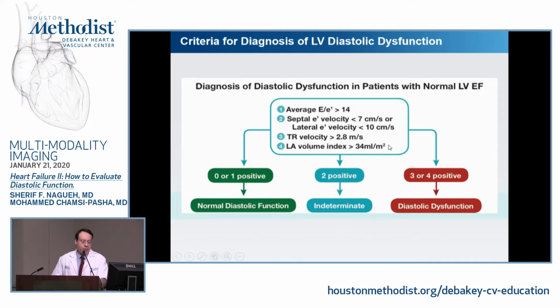As you can see, it's an important variable for diastolic dysfunction, but I would also submit it's an important variable that you want to measure correctly in all patients, be it patients with heart failure, with arrhythmias, with mitral valve disease, and so on. If the majority of the signals fall outside these ranges, then the patient has diastolic dysfunction and usually elevated LAP, because many of them foretell you that the LAP is up. If they fall in the normal range, it's normal, and in between, it's indeterminate. The yield of indeterminate, if you take everything into account, should be of the order of at most 10 to 15%.